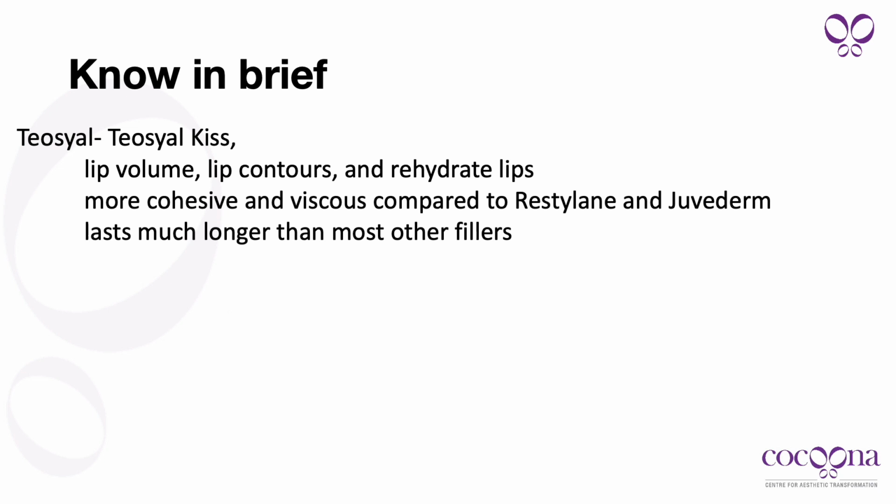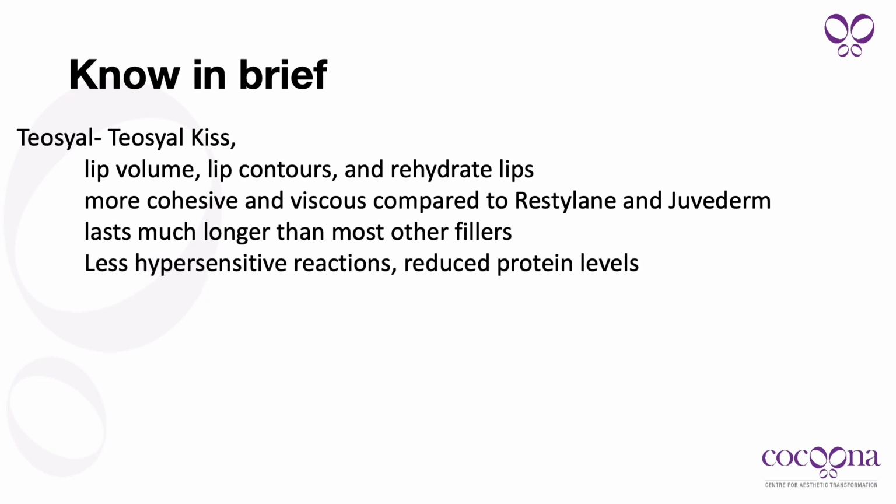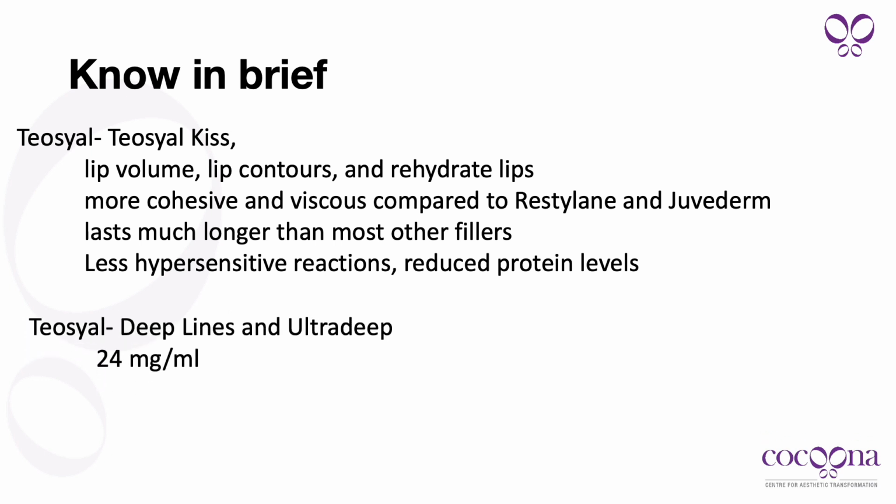It is more cohesive and viscous, and that's why there's more risk of lumpiness. So it's good to inject people with thicker mucosa or inject deep in the lip, but not for superficial hydration. And it definitely lasts much longer than most other fillers. It has less hypersensitivity reaction because of reduced protein levels.